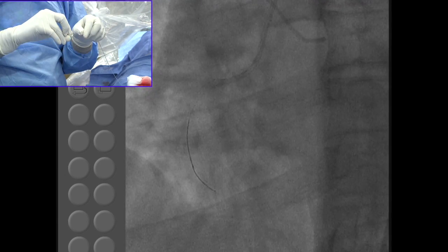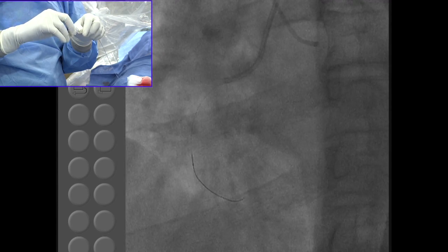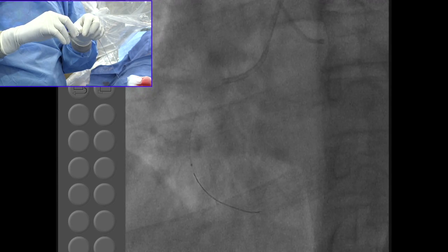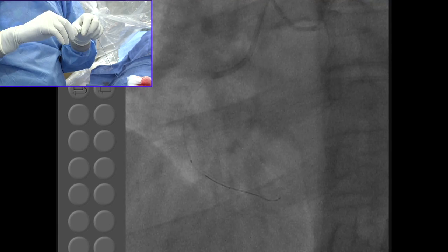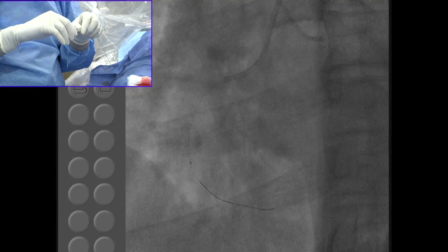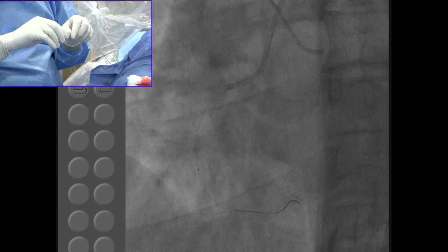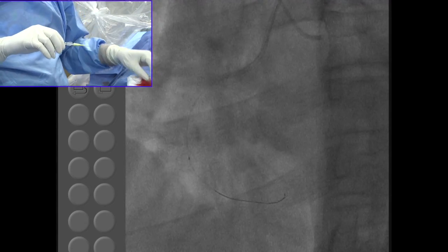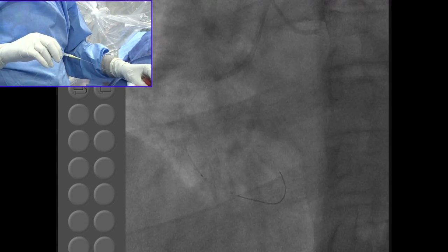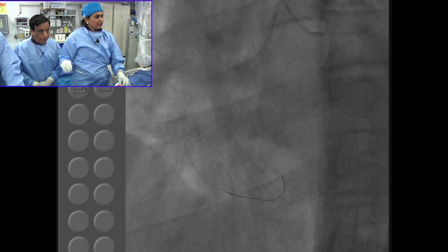And this is actually very interesting. In this young person, there was no clinical event, and he just has a new onset of class 2 angina and looks like a short CTO. And this is actually better than what it was before. It is not uncommon that once you treat your other vessels and give antiplatelet therapy, those patients' vessel may develop some antegrade channel or a shorter duration of occlusion.